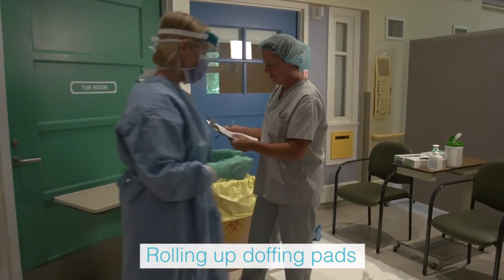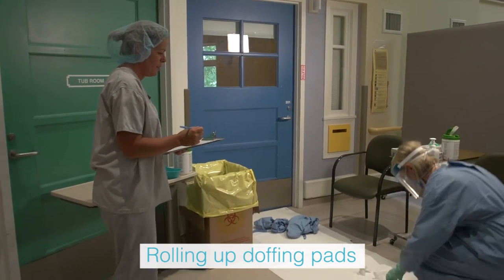The trained observer rolls up both doffing pads gently to avoid contamination.